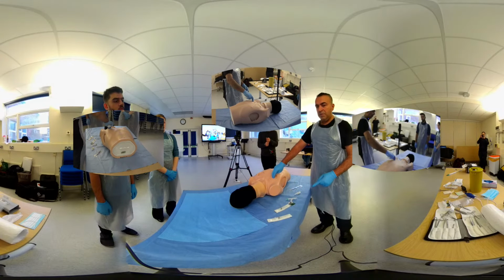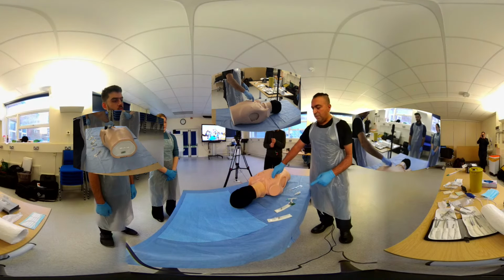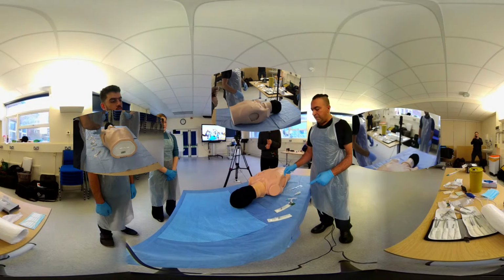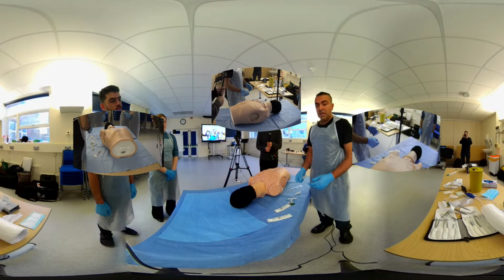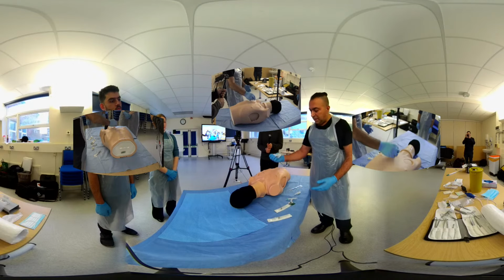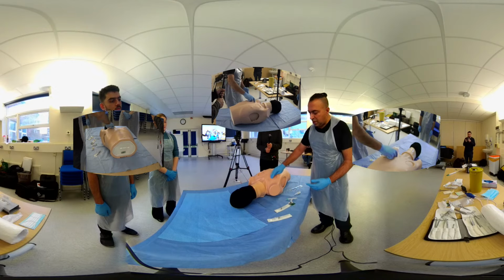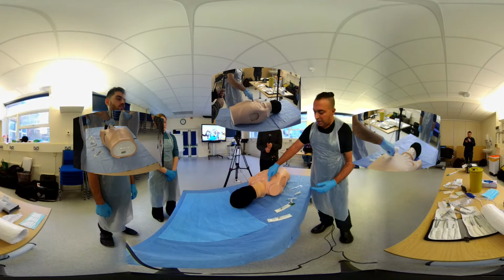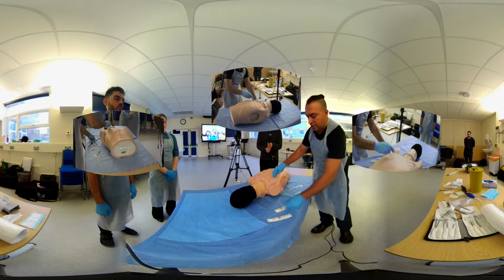It should be fairly obvious to feel as a little notch, a little indentation, and you're trying to get above that rib. I'm explaining it now to you in slow motion, but to do this in real life probably takes 5, 10, 20 seconds. To explain it, you clean it and then make sure your anatomy is okay. Explain to the patient: second intercostal space, mid-clavicular line, and that's the notch that you're trying to feel. Make sure that you're happy with that.